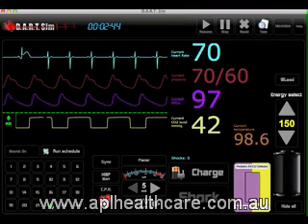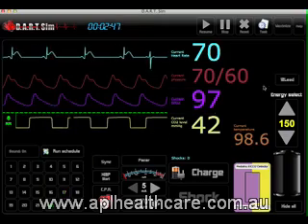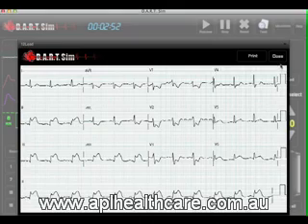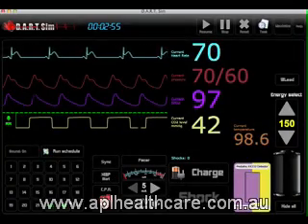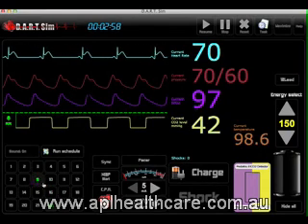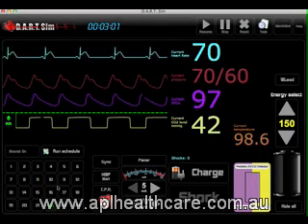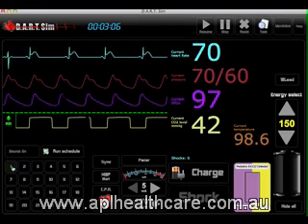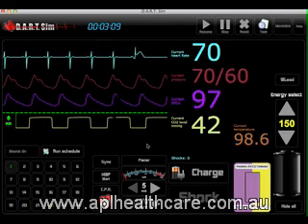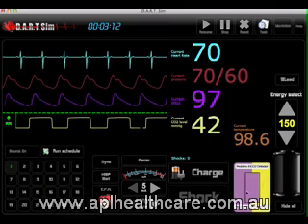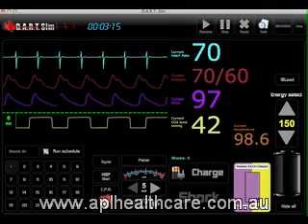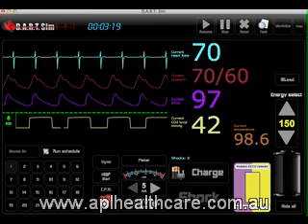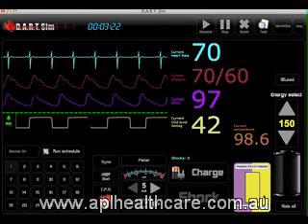At any time you can also change the rhythm manually and get a 12-lead as well. We have 24 different 12-leads that will be displayed on whatever rhythm you decide to choose. For NRP courses, if capnography is not utilized, you can also use the pediatric end-tidal CO2 detector here by simply clicking on the detector to notify the student that they have a good tube placement.